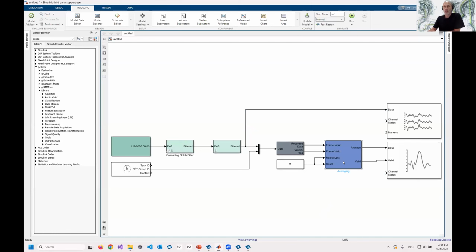And if our experts are on board, then we are talking of 2, 3, maybe 5 hours to set up a new experiment. So it's very fast and quick to test something out. And in Python, of course, you must be a programmer to know how to do it. For modifying the Simulink models, you don't need to be a programmer.